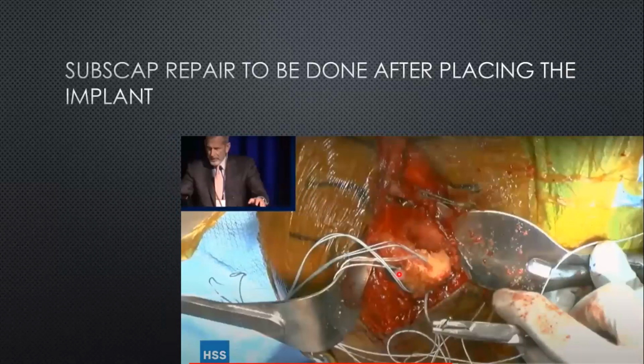Before you finally reduce it, you make sure that you take enough stitches through the bone for reattachment of the subscap. That is extremely important. Subscap repair, it is still a very, very controversial topic of discussion, but all doctors agree that if it is a possibility to repair the rotator cuff prior to closure, please do so. We don't want that to be free floating in the shoulder. And it also has an additional benefit: the dead space is reduced if you repair the subscap.